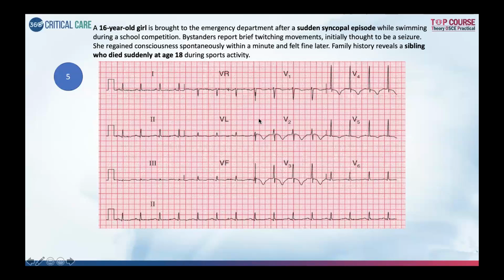Okay, I already see somebody writing, Dr. Deepak, long QT. Okay, very good. So here, the history is very typical.